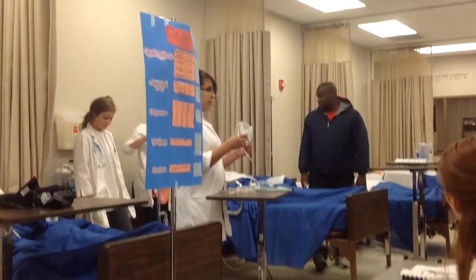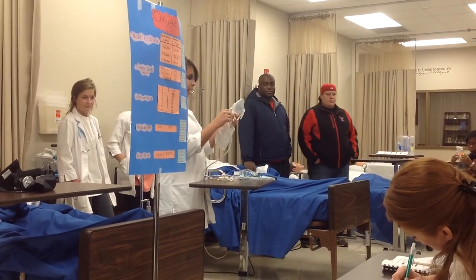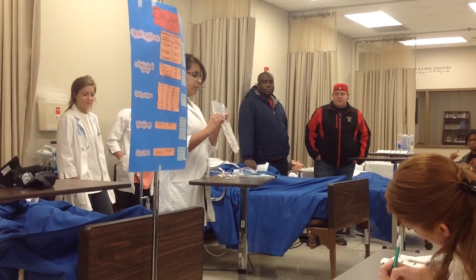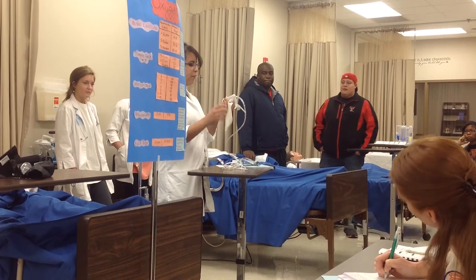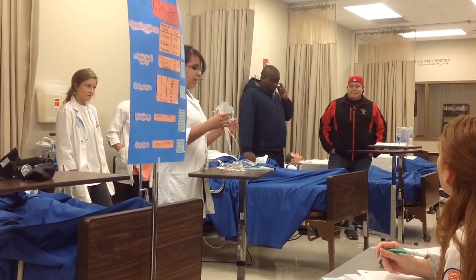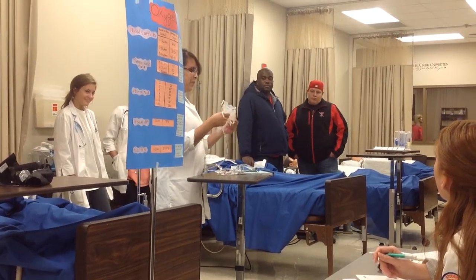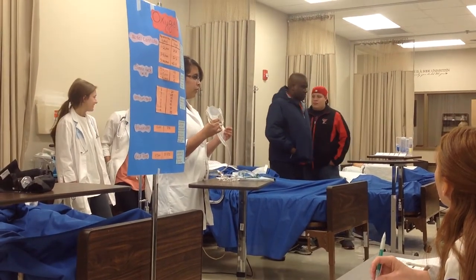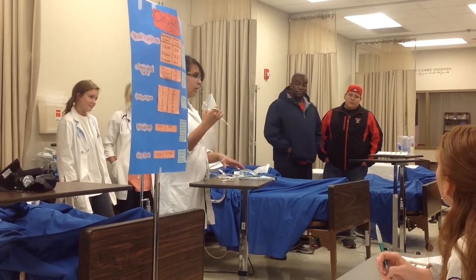This is called the reservoir mask, or the rebreather. To inflate this, you have to put your thumb right here, and it just inflates the bag. You have to come back and check it to make sure the bag has not been deflated. This delivers a high percentage of oxygen. But the patient is breathing a lot of CO2.